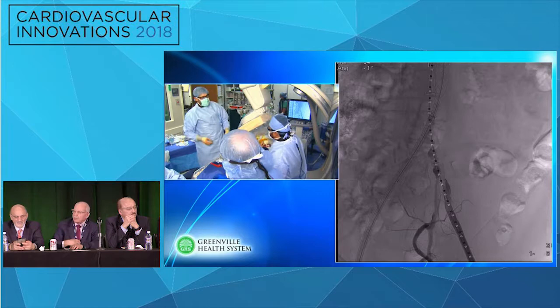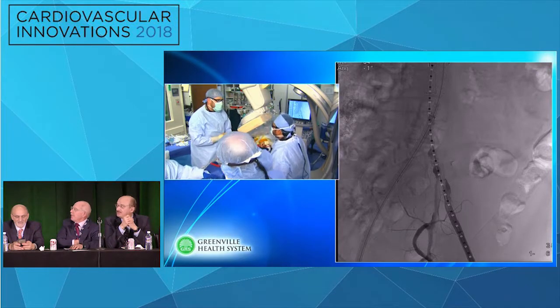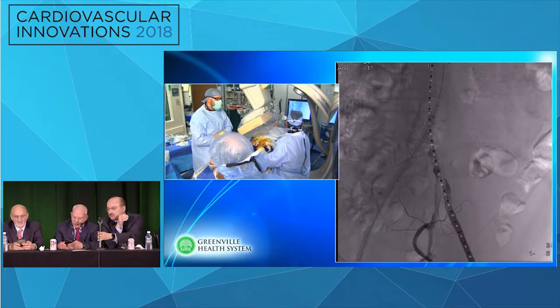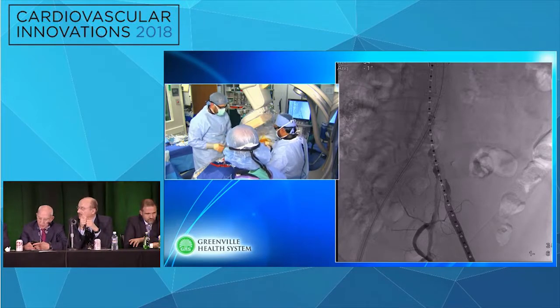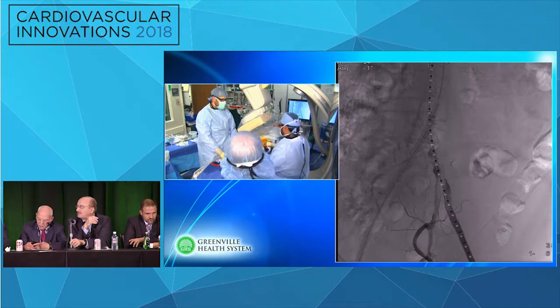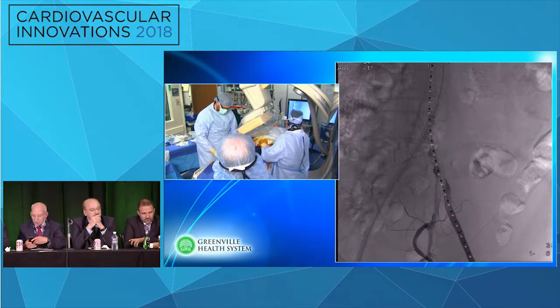You can avoid the hypogastric completely here, is that right? You can avoid it completely. I usually go longer than shorter because I can manipulate the longer a little bit, almost half a centimeter. I'm going to ask maybe 12 by 14, your choice too, and land it just above.